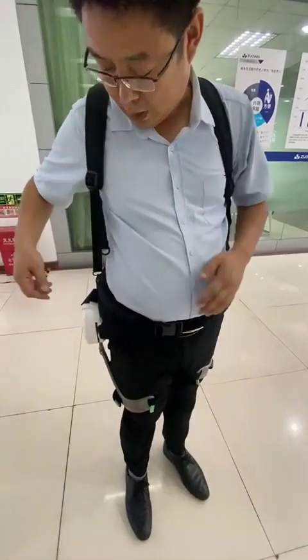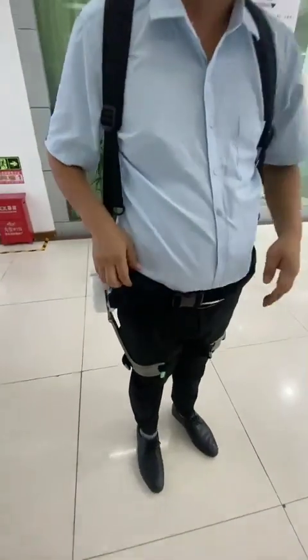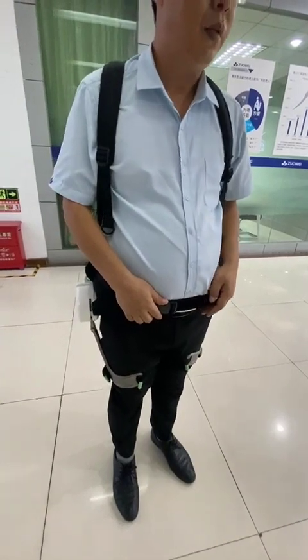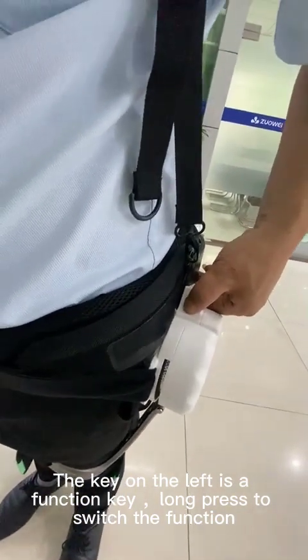After you finish wearing, the outside is the right hand. Power on — press the on button and hold for a moment. The key on the left is a function key. Long press to switch the function.